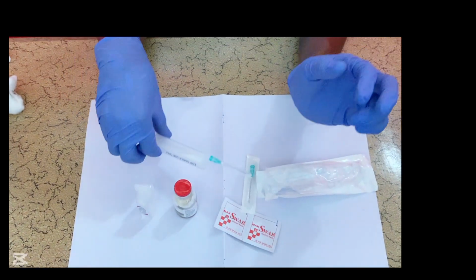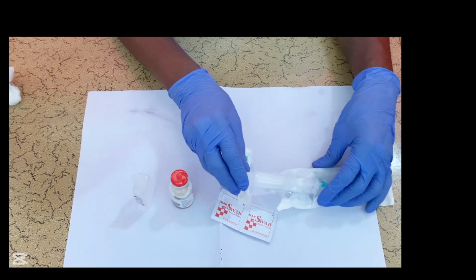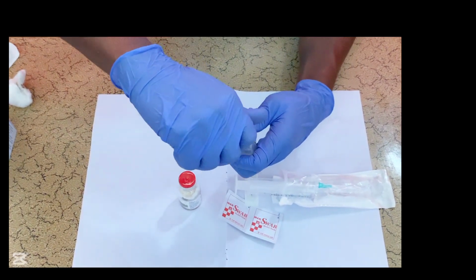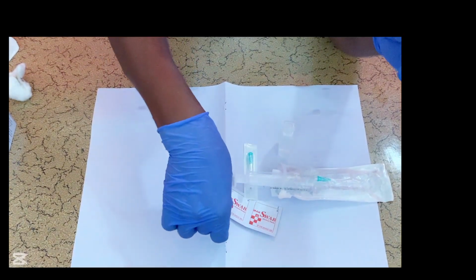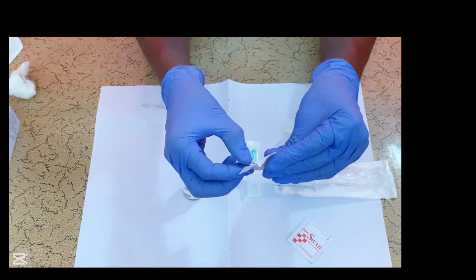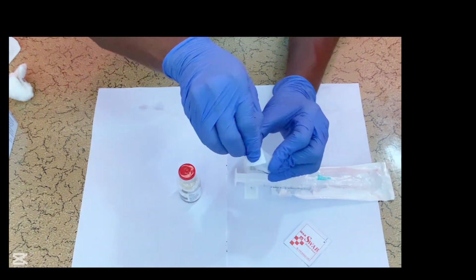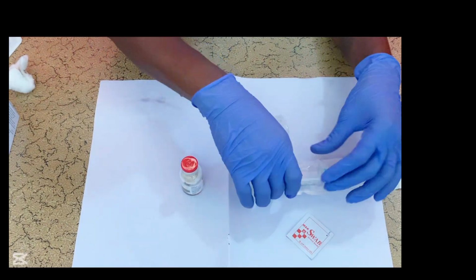Then you put it back into the packaging to maintain the sterility of the syringe. Then you get the sterile water for injection contained in the plastic vial. You open it. Then you get an alcohol swab. Then you clean the opening of the plastic vial. Make sure you clean the opening of the plastic vial before you start withdrawing the water for injection.